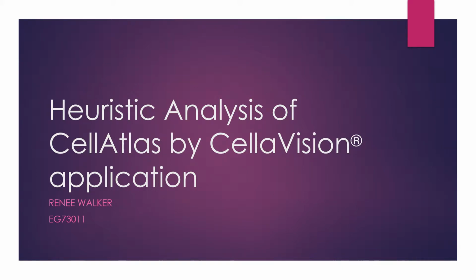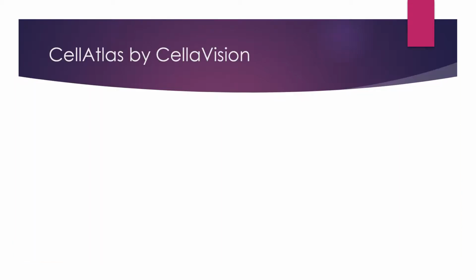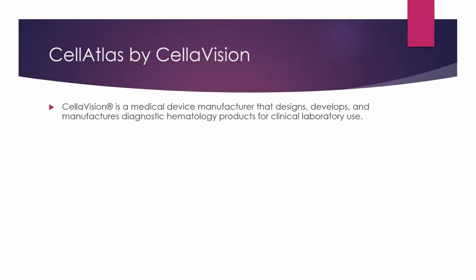Hi, my name is RWalker, and this is my heuristic analysis of the Cell Atlas application. This application is put out by a company called Cellavision. They're a medical device manufacturer. They mostly do diagnostic equipment for hematology that's used in the clinical laboratory.